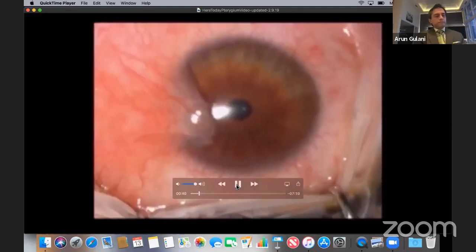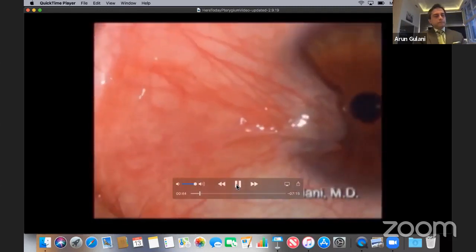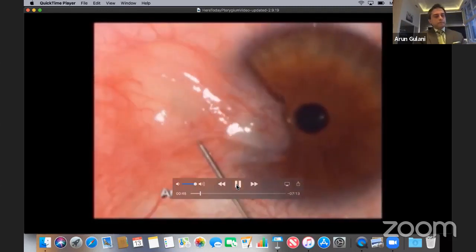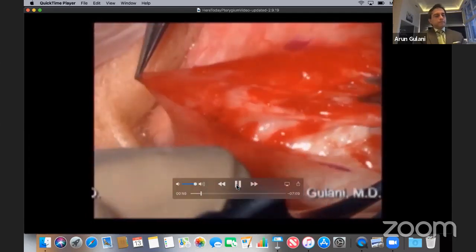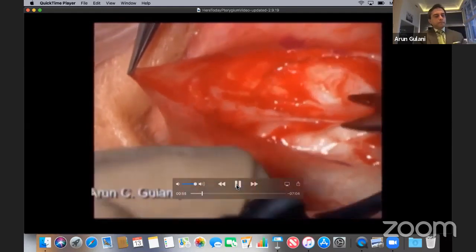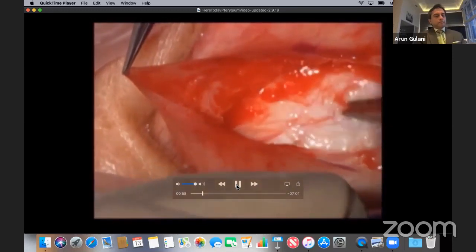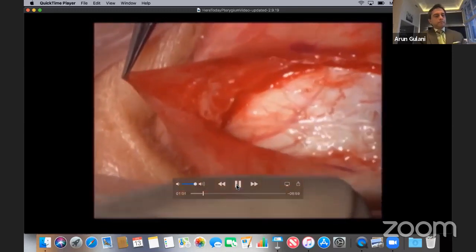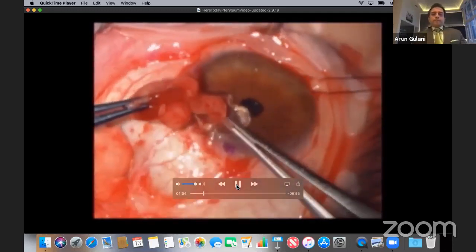In this case of pterygium, I first start with a fixation stitch, followed by delineating the entire pterygium with intralesional anesthesia. Trace the entire pterygium down to its roots, anatomically delineating, literally cutting down its tentacles as it gives way, and the entire lesion is seen as here. Peel off the corneal portion from posterior to anterior movement.